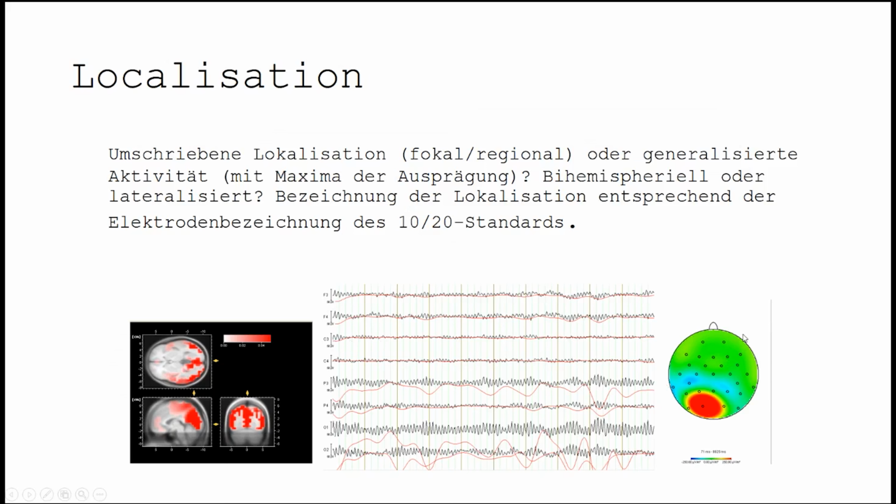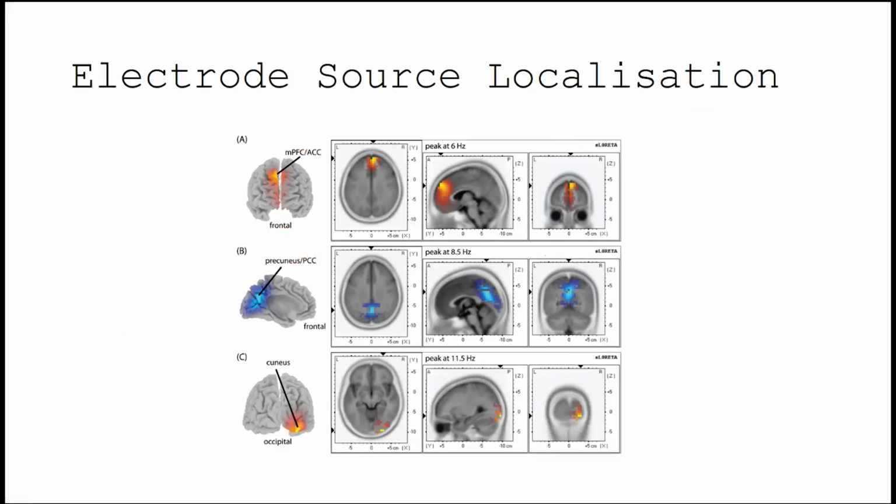You can see the most prominent alpha activity, O1, O2, is here, signature red. So you can see where it happens on the skull. But can we also dive into the brain? And yes, we can, using something called source localization. And this is how you see in the occipital brain, the activity is largest for this alpha activity, where you can see the envelope printed in red. So how does this work? Well, let's dive into that.